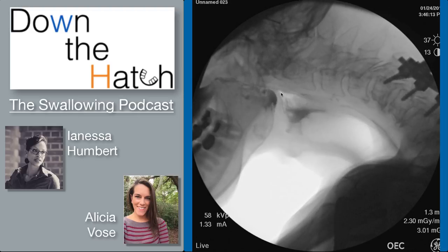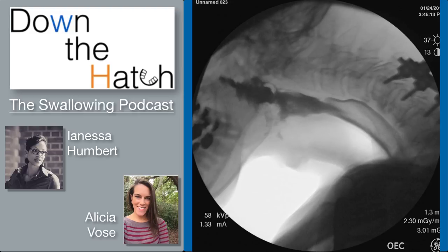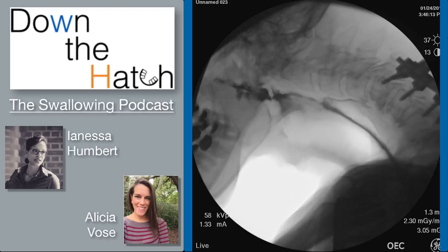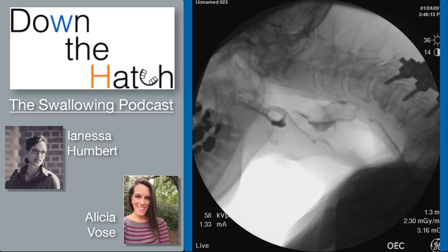We can see the epiglottis does at least go toward the pharynx — the back part, hopefully the tongue's role. It did get back, but does it get down? This is where pharyngeal constriction is supposed to help get the free end of the epiglottis to overlie the arytenoids, and we don't see that happening here. The epiglottis's role is to allow the bolus to go around it — we can see bolus likely in front and behind it, though we can't tell for sure with fluoroscopy because of depth perception. Despite the epiglottis not inverting, this person did not clearly penetrate or aspirate.